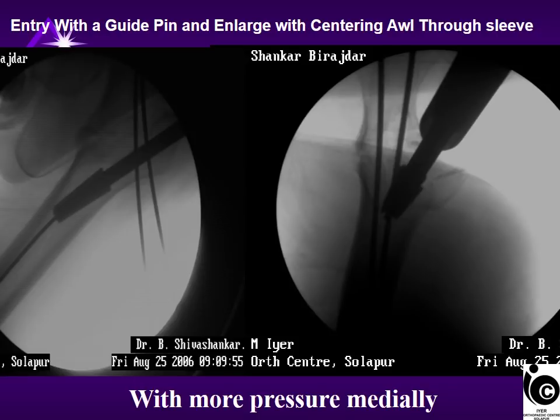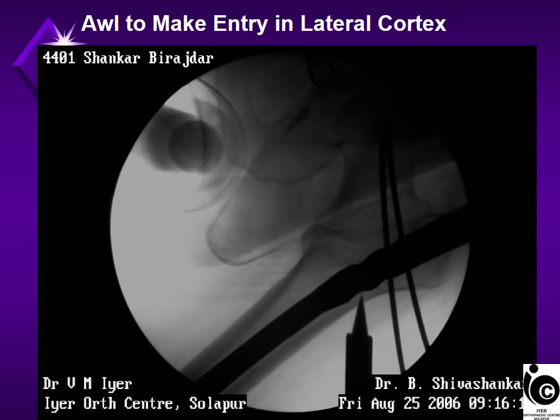This is the entry being made with the centering awl. After insertion of the nail, always use an awl to make a hole in the lateral cortex of the femur. Our guide wires, 1.8 or 2 millimeter guide wires, are thin and long. They are not made for drilling the cortex of the bone. They go haywire, they bend. So to avoid that, always make a hole in the lateral cortex with the awl which comes with the set, or make a hole with a drill before passing the guide wire.